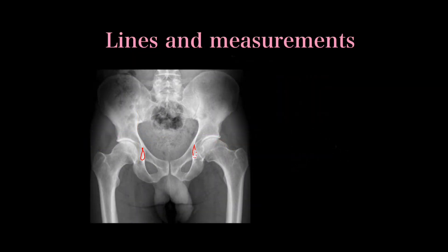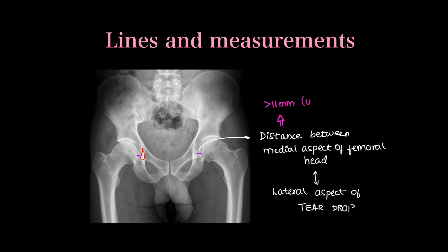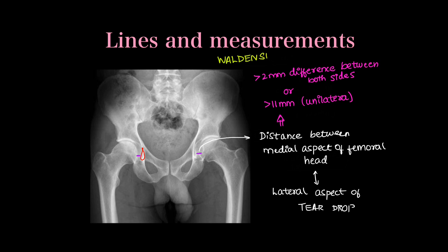Before the Waldenström sign, we note that a normal AP hip x-ray shows a teardrop shape at the intersection of lines. We measure the distance between the medial aspect of the head of femur and the lateral aspect of the teardrop. If this distance is more than 11 mm unilaterally, or if there is a difference of more than 2 mm between both sides — which is more relevant and reliable — then the Waldenström sign is positive. An increased distance is a highly specific sign for hip effusion on that side.